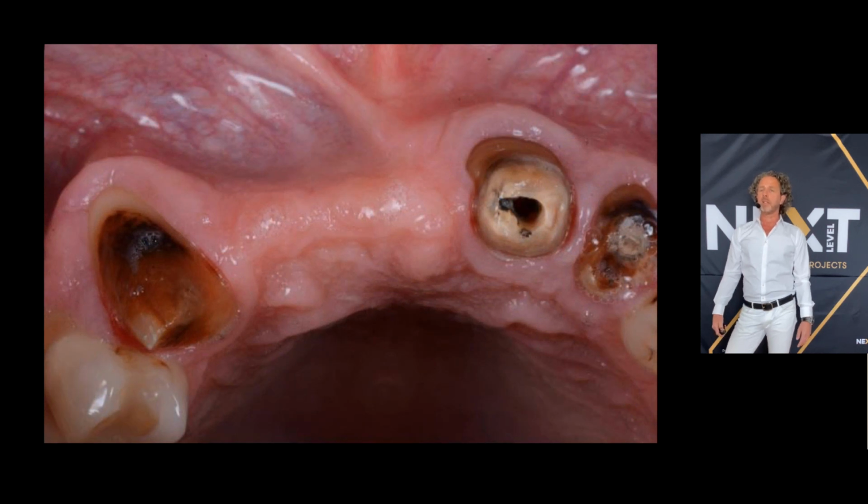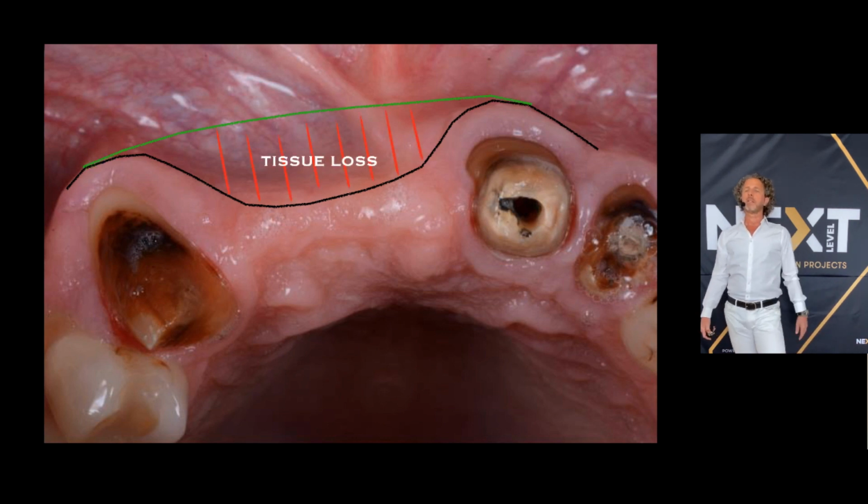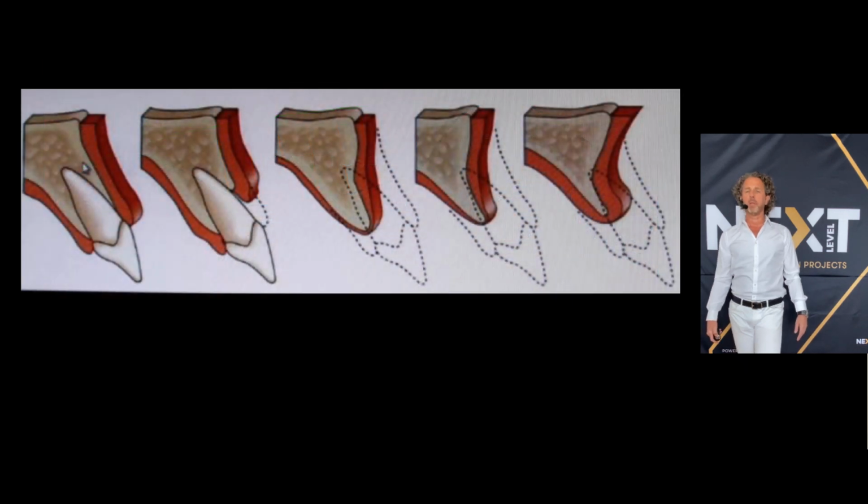Just look at this implant site. These two adjacent teeth needed to be removed a good couple of years ago, and this is the tissue loss. Just look at how compromised this site is. How can we place implants?